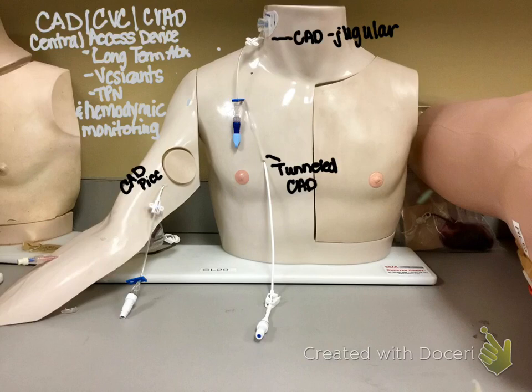And then I think your checkoff also talks about, y'all probably did the checkoff in 3, but you want to make sure that these things haven't migrated, so there's usually numbers on them, to make sure. Never ever push it back in anybody. If it looks like it's migrated, they need an x-ray. We don't push it back in. That's a surefire way to get an infection, right? And because it's going right outside the heart, you don't want to cause an infection to the heart. So just keep that in mind.